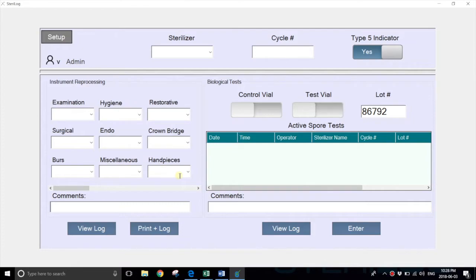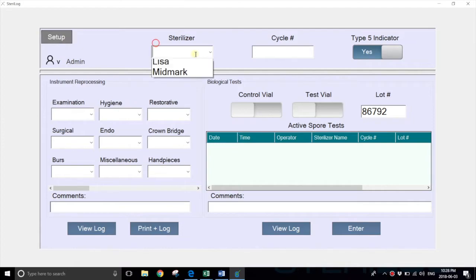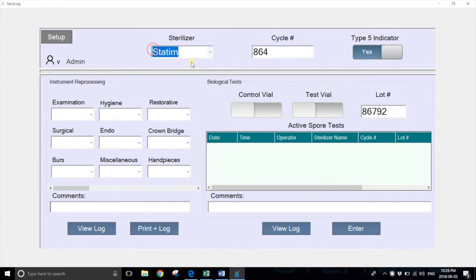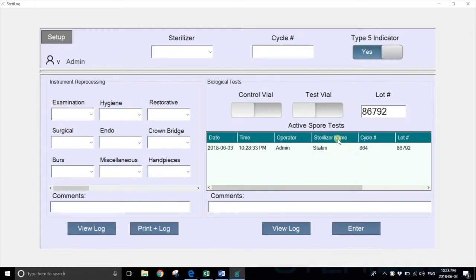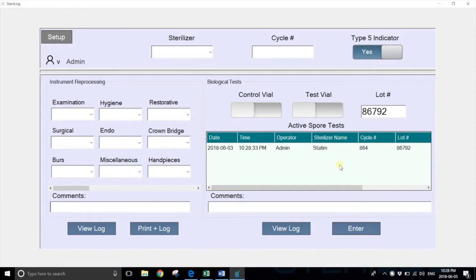On a regular day, an operator would typically enter a biological indicator with their first instrument load. They would select the sterilizer and let the system auto-populate with the cycle number. You'll notice that the lot number has been retained from the previous cycle. They would hit enter, and a spore test has been added to the active log. This means the spore test is either in the sterilizer currently or in the incubation period.